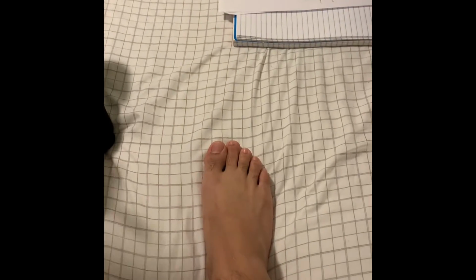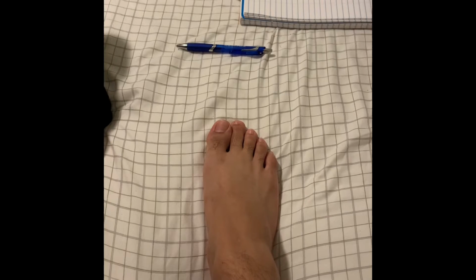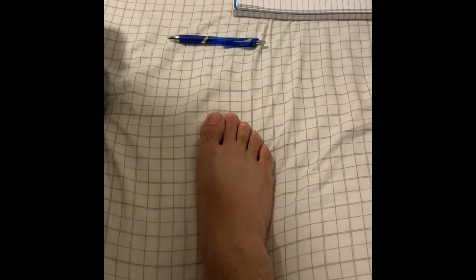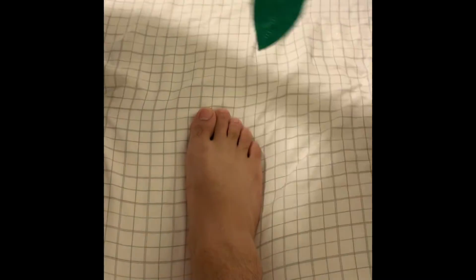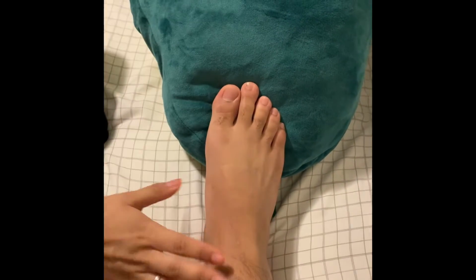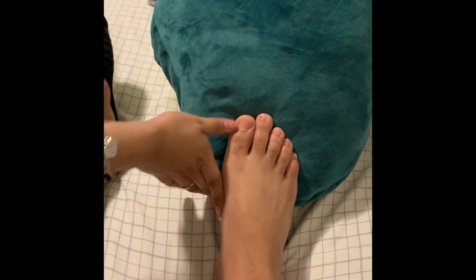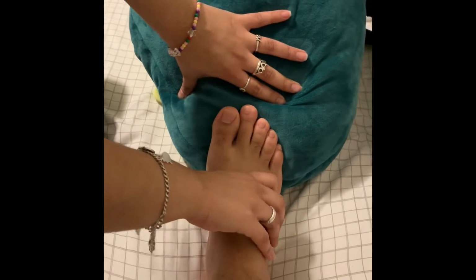Okay, so on this position right here, we're going to be doing the foot and the AP axial. So for the AP axial, you're going to have something underneath the toes so that it can be lifted up. At one point, sir, can you lift up your foot for me, please? Yes. We're going to use this avocado here. And you want it to be like this because that's the AP axial form. If it was just AP, it would just be down like this. So you put your foot right there.